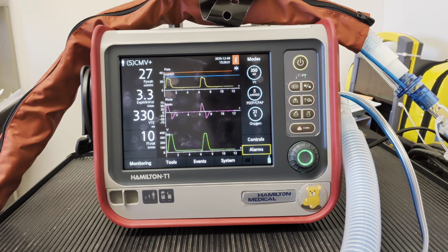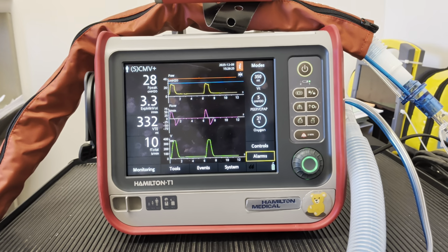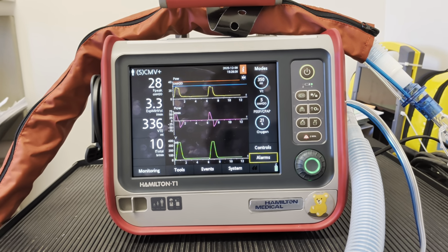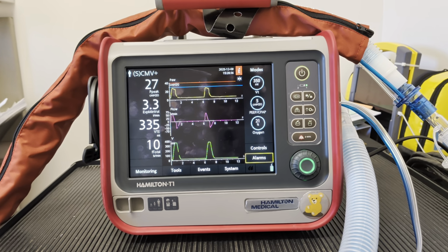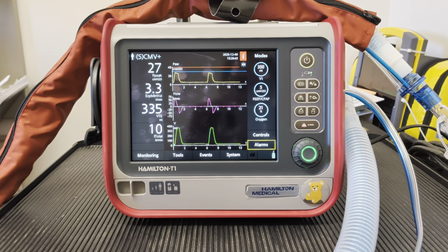I'm going to focus more on ventilator interaction and patient physiology. You all, of course, should be familiar with your immediate action drills if your patient's condition suddenly changes. The whole DOPE. I think DOPE is a good starting point. So those are your immediate action drills, if you will, your most pressing differentials: displacement of the airway equipment.